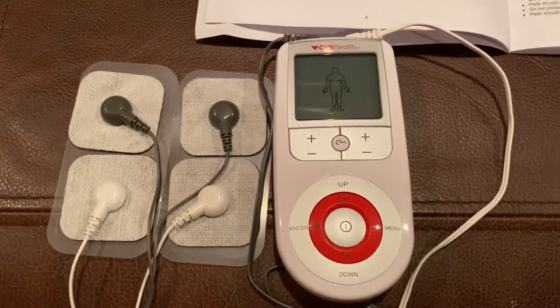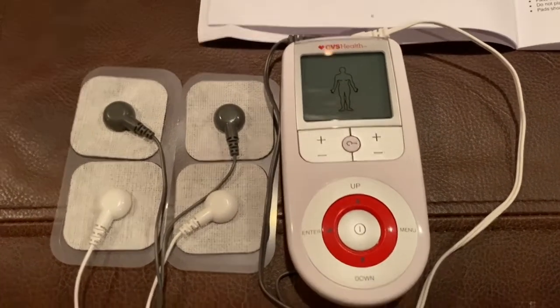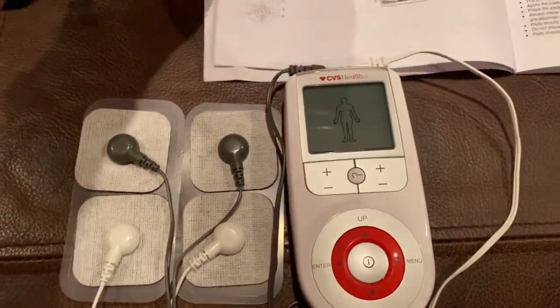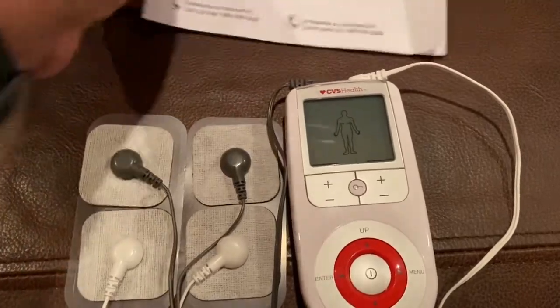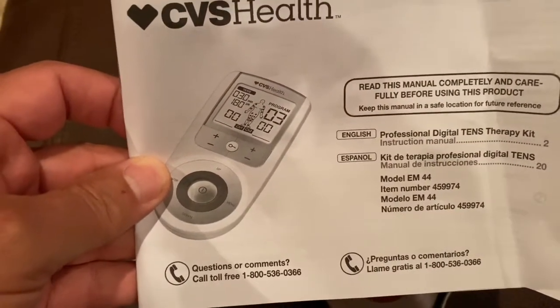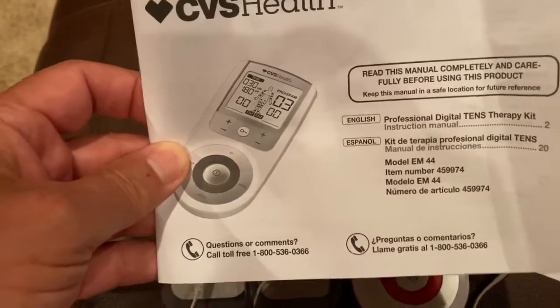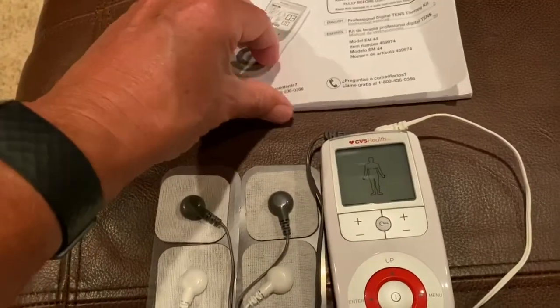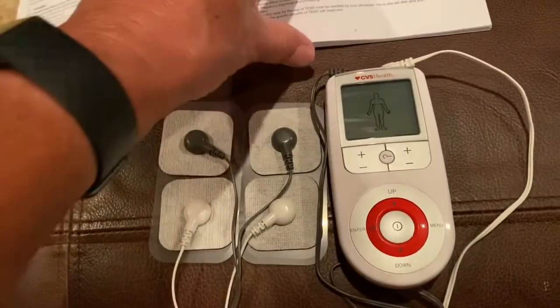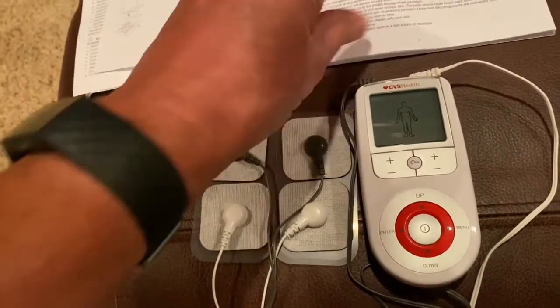Here we go again with another look at the CVS Pharmacy TENS unit. These are very popular if you're having some kind of pain. You may have seen my previous YouTube video on this earlier. I'm going to give it another try — I'm having some shoulder pain; I actually have an impinged shoulder area.